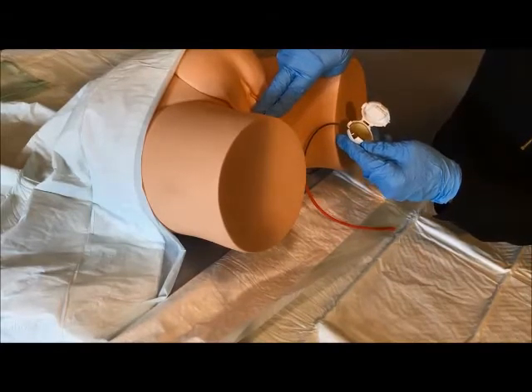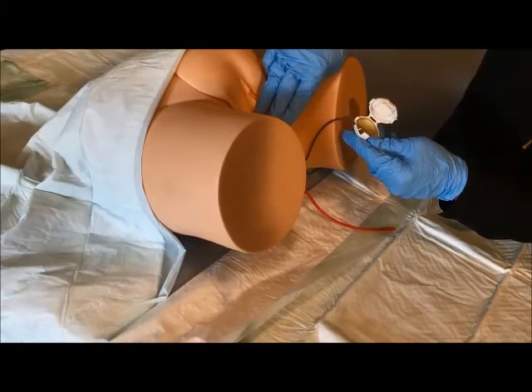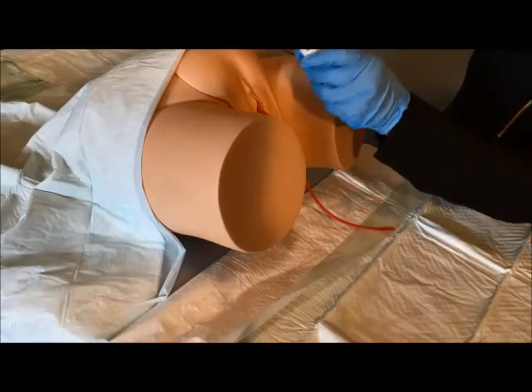Place the actuator on the catheter three to four centimeters from the point at which the catheter exits the body. In females, leave two fingers of space between the actuator and the patient. In males, leave three fingers between the actuator and the patient where it exits the urethra. Make sure the actuator connecting cable is going towards the patient.